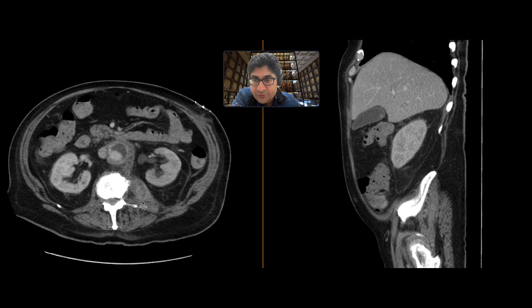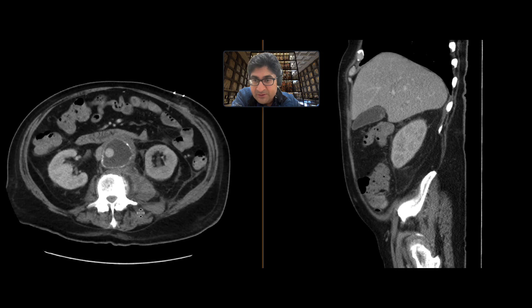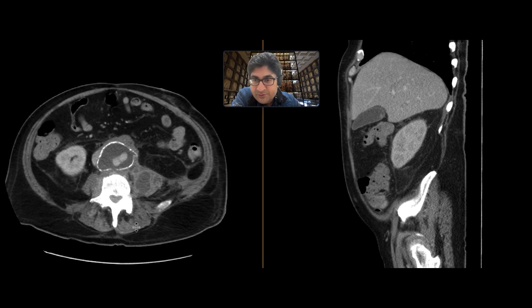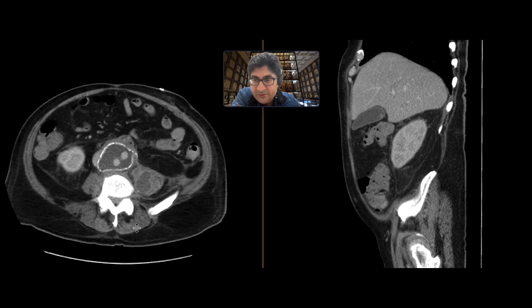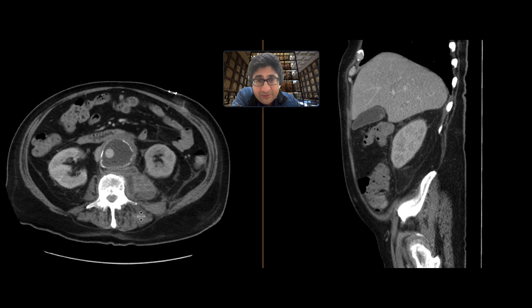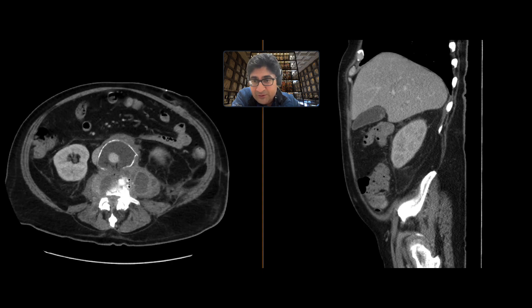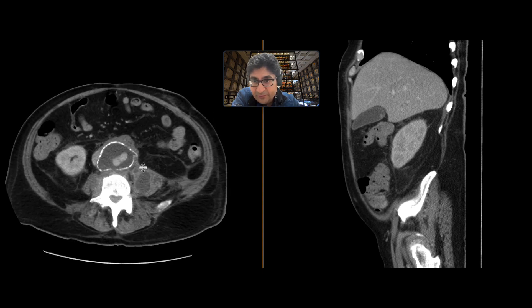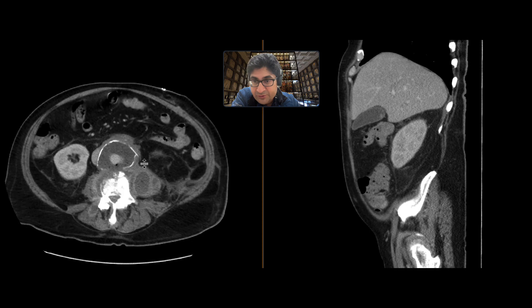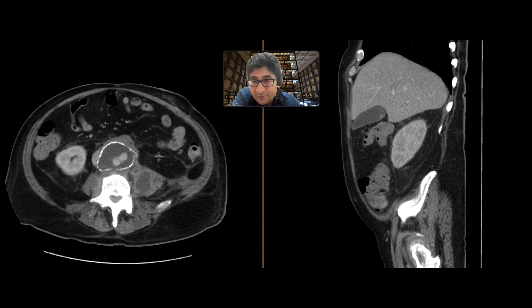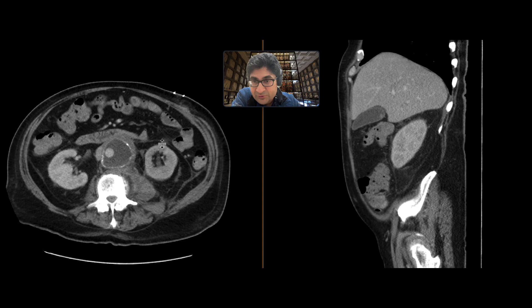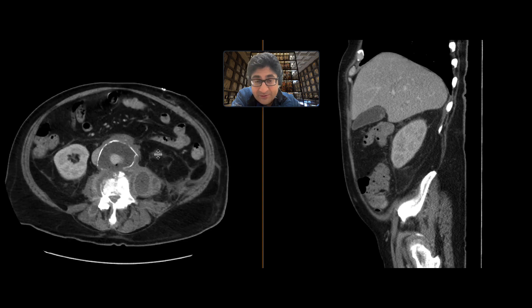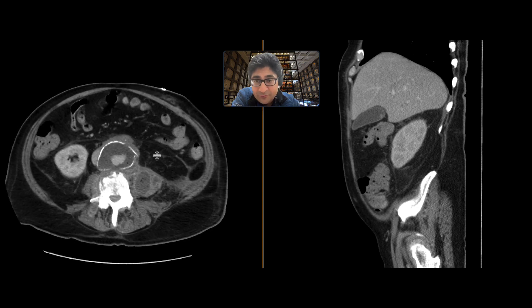As I scroll down to the mid-abdomen, we can see that this patient is post-aortic graft placement for an aneurysm, and that graft doesn't look too well. We can see that the shape is quite irregular. Posteriorly, a portion of the graft is missing, and we see all these foci of gas within this excluded sac over here. That's highly concerning for infection.